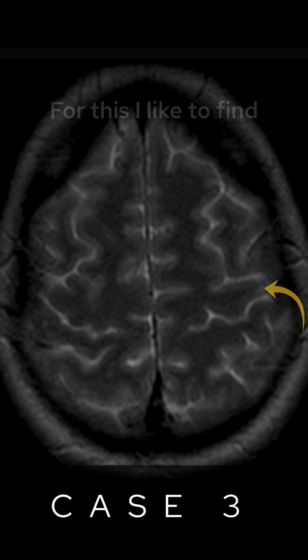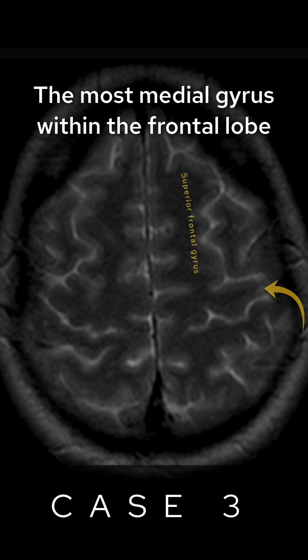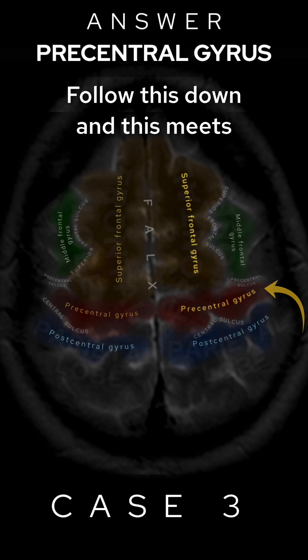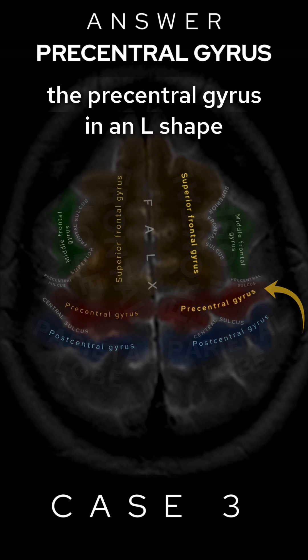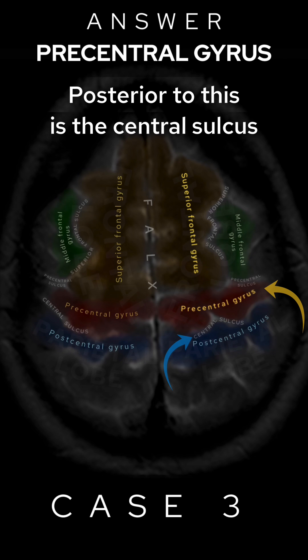For this, I like to find the superior frontal gyrus — the most medial gyrus within the frontal lobe. Follow this down and it meets the precentral gyrus in an L shape, which is the site of the primary motor cortex. Posterior to this is the central sulcus.